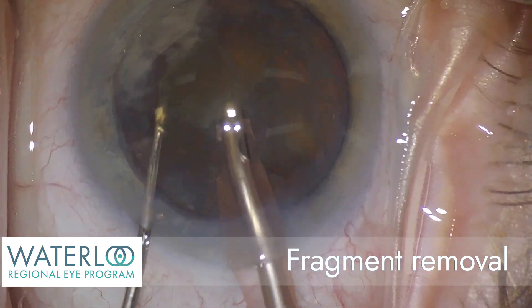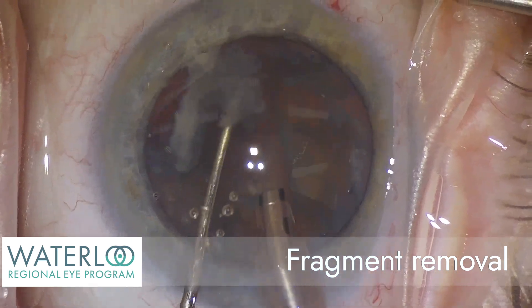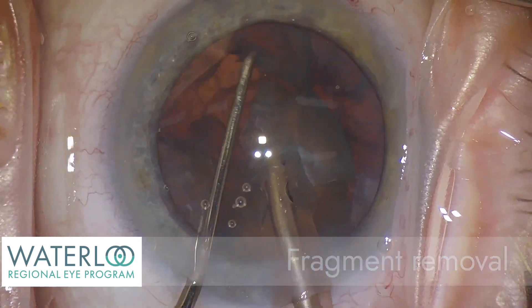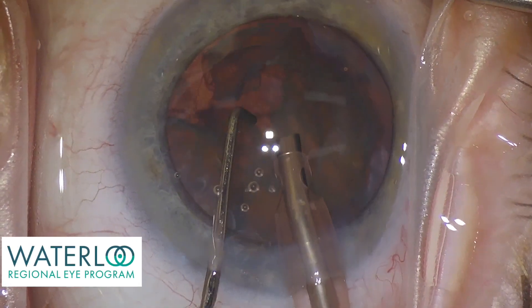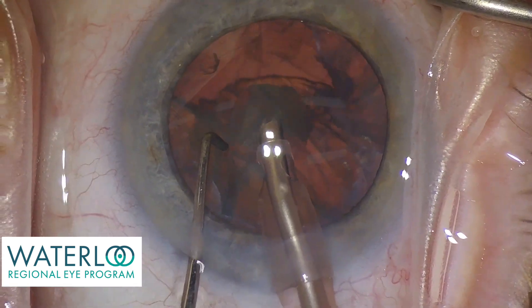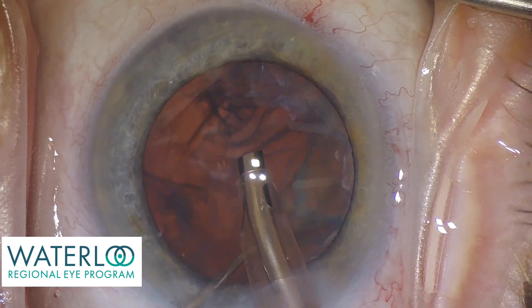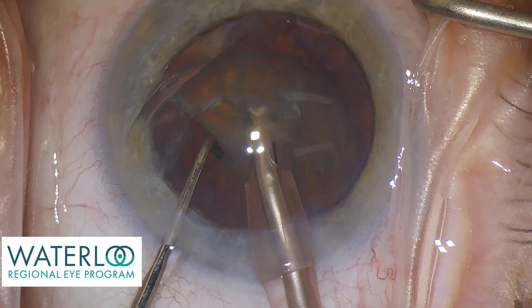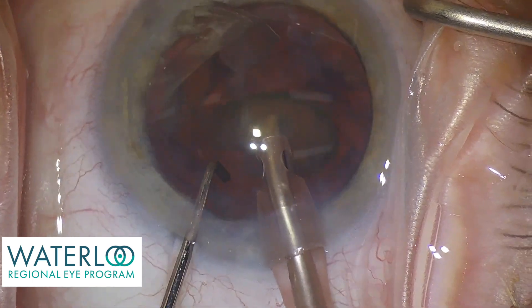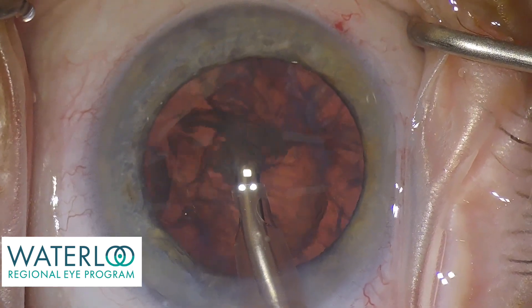The cataract fragments are removed with specialized fluid and the ultrasound energy of phacoemulsification. The final fragment is now being phacoemulsified. The main part of the cataract, the nucleus, is now removed.